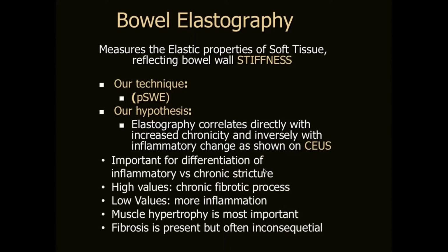So now, we saw a very nice presentation about looking at bowel elastography using strain, and in our institution we use point shear wave elastography. And so our hypothesis, looking at strictures in patients with Crohn's disease, at the start of our study was that the elastography correlates directly with increased chronicity and inversely with inflammatory change, as shown on CEUS.